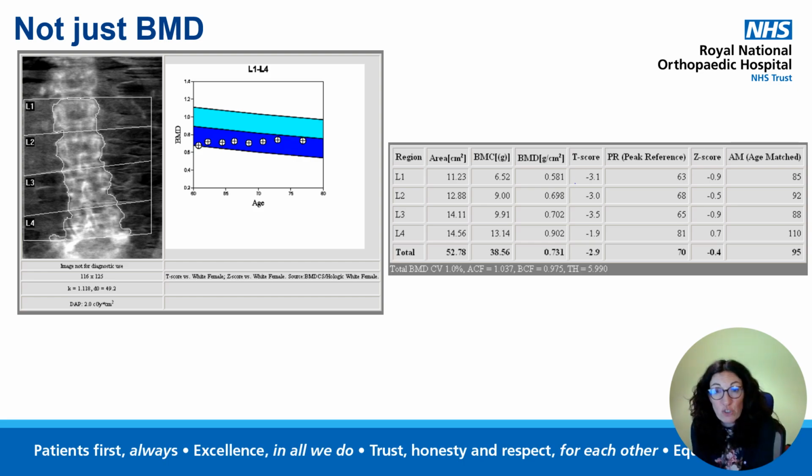Now, this should have been excluded from the study, but it wasn't on the day. And I looked at this in clinic, and this is a vertebral fracture. So we can get information from DXA that is going to change our management practices.